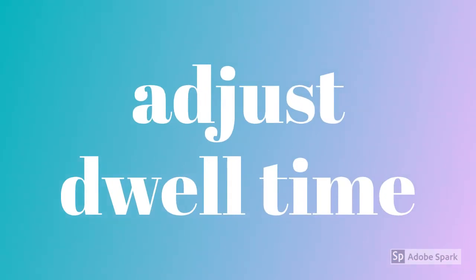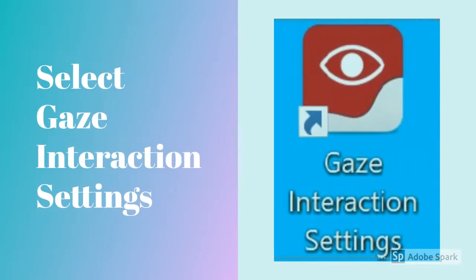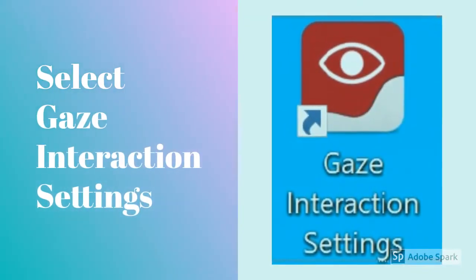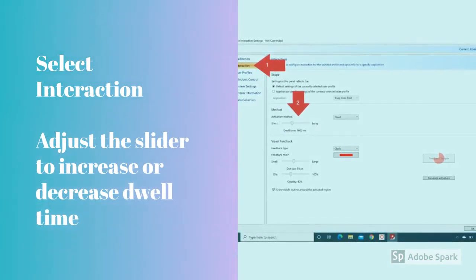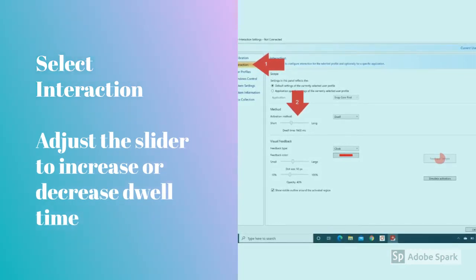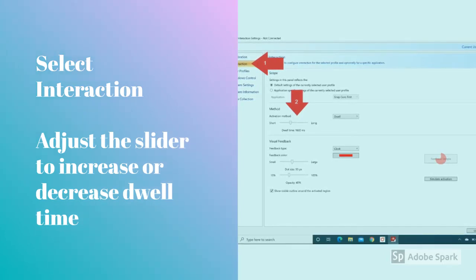If you find your student is selecting a lot of random messages, you may need to adjust the dwell time. This is the amount of time you need to look at the symbol before it's activated. First, select Gaze Interaction Settings. On the left-hand side, select Interaction. Then adjust the slider to increase or decrease the dwell time. If your student is making a lot of random selections, you're going to want to increase the dwell time.